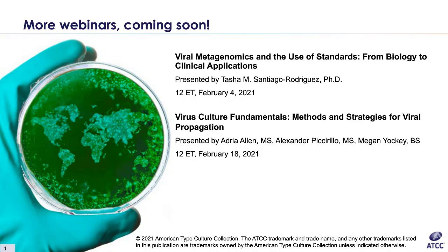Yeah, I mean, 0.22 micron filters are generally more than enough to remove any sort of contaminants from your media if you want to do that. Filtering would definitely be probably the recommended way to go with that. Yep. I would go along with all that.